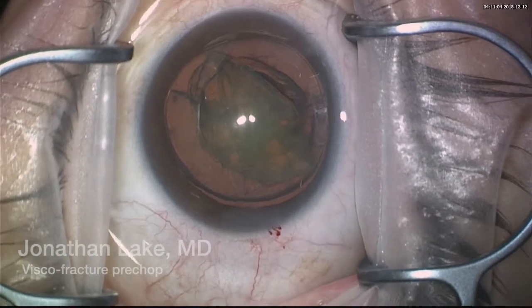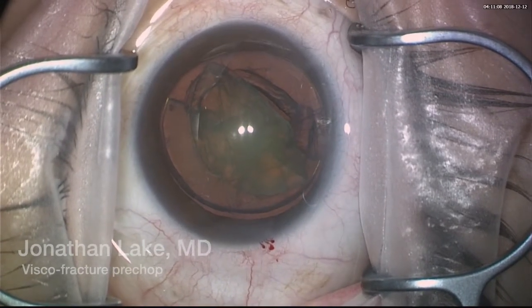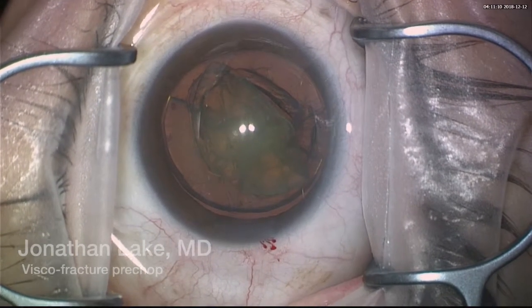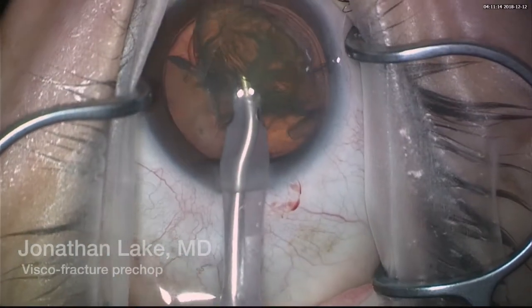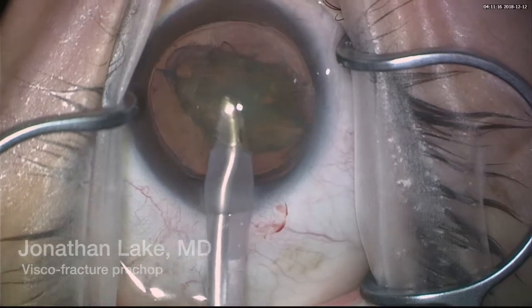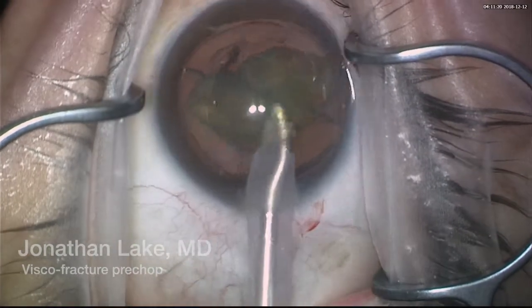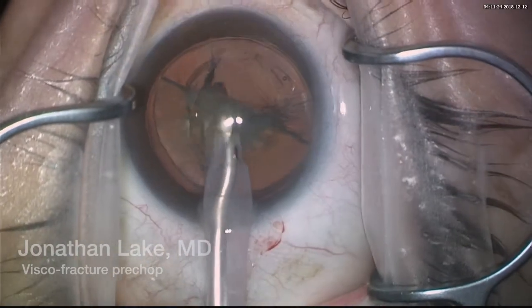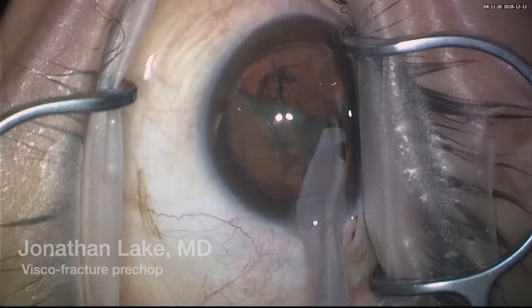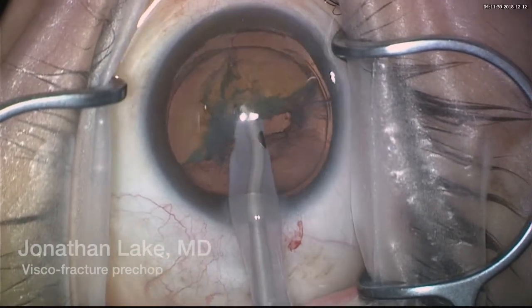I really love pre-chopping. I think for a soft nucleus — here it's almost a one-to-two grade nucleus — we're able to achieve the fracture, and this helps a lot with the one-handed technique. Basically I'm using high vacuum and low irrigation because we're using the Centurion. I'll rotate the second half.